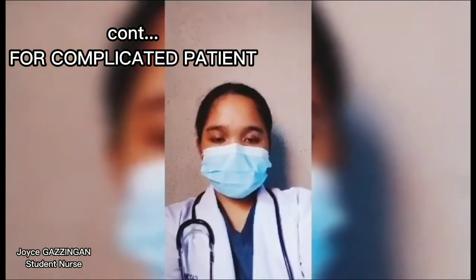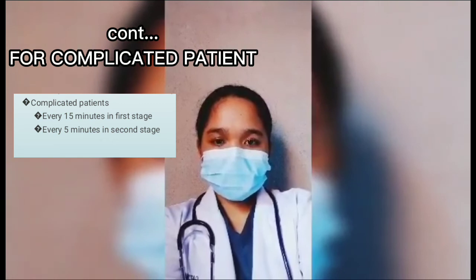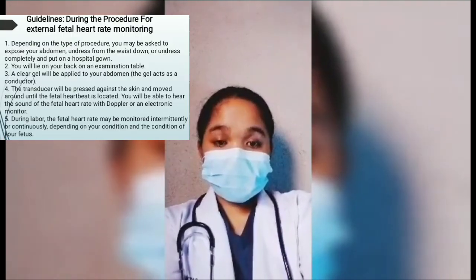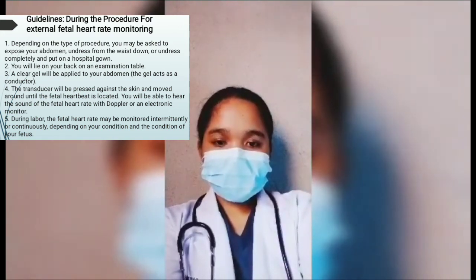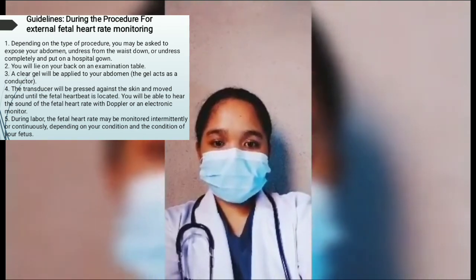Guidelines in reviewing fetal heart rate monitoring. For the complicated patient, we have the first stage wherein the patient should be reviewed every 15 minutes, and for the second stage, the patient should be reviewed every 5 minutes. Guidelines during the procedure for external fetal heart rate monitoring. First, depending on the type of procedure, you may be asked to expose your abdomen, undress from the waist down, or undress completely and put on a hospital gown.